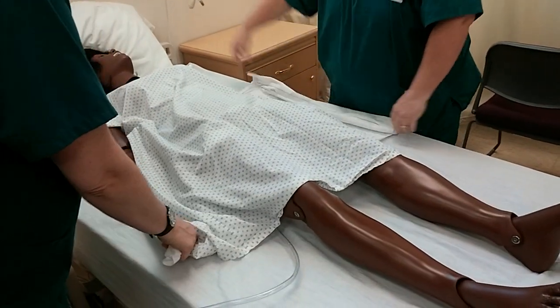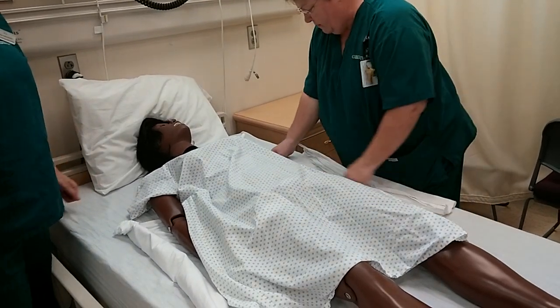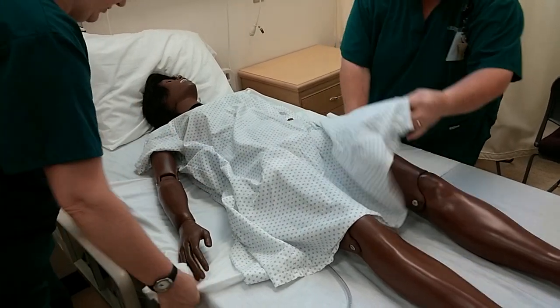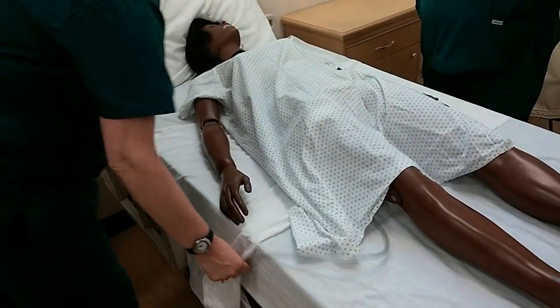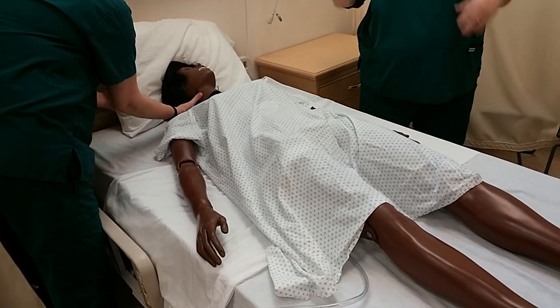One, two, three. We're going to move her up and then forward. Now, do you see why we have a pillow there? Because she is fairly lightweight and we both have pretty good muscle. So then go ahead and make sure the turn sheet is flat underneath the person, and tuck it down to the side of the bed. Then put the pillow back under the person's head and make them comfortable.